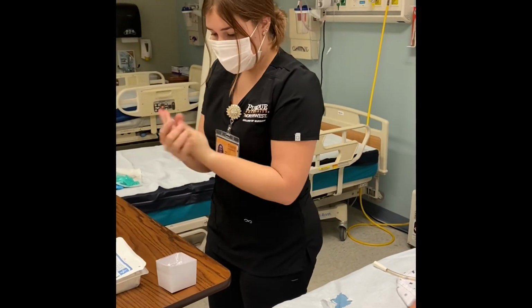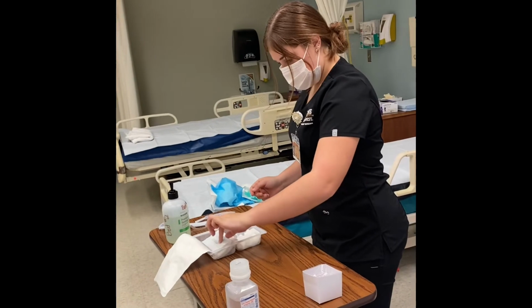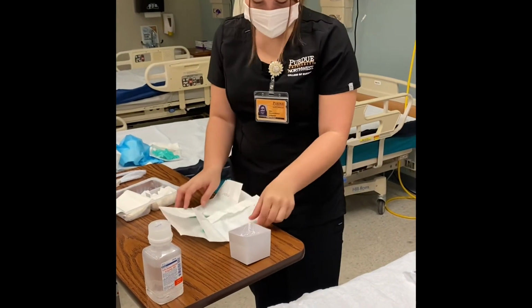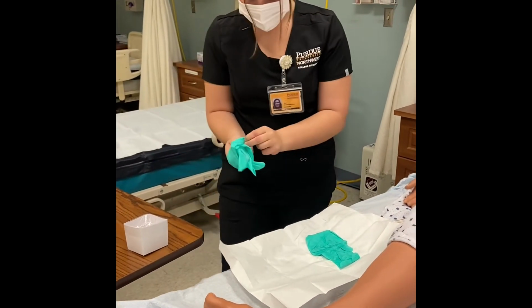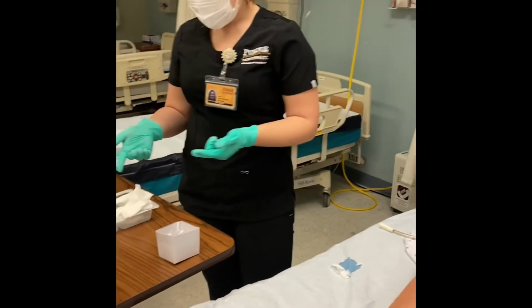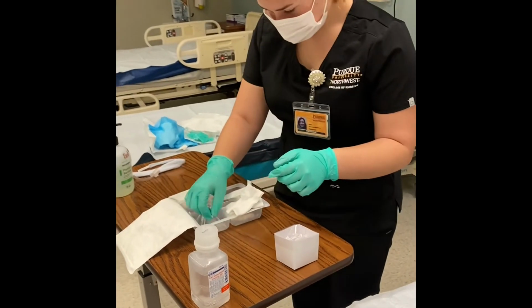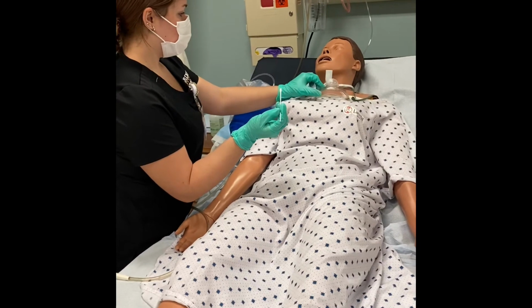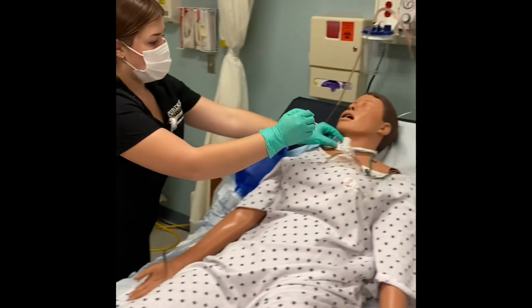And then next I will be doing the trach care. So I would open the cleaning tray, making sure to only touch the outside. I would put on the sterile gloves. Okay, so once I have my sterile gloves on and I poured new saline into my container, I am going to take the Q-tip applicator and dip it in the normal saline. I'm going to clean behind the plate while holding it in place with one swipe. Discard that, take another, and do underneath.